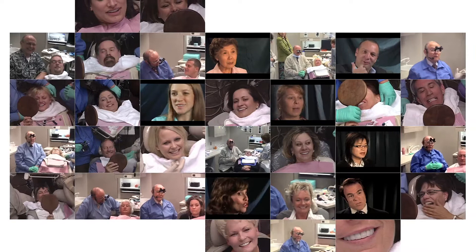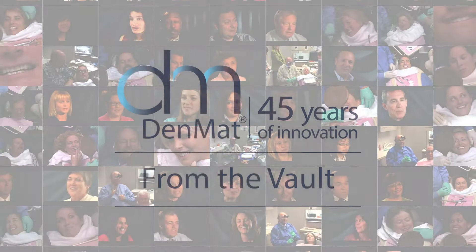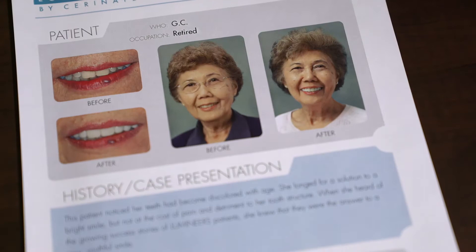And now we're not treating teeth anymore. We're treating smiles. Isn't that beautiful? Let's look at the transformation from where we started and where we are. Our patient today is an example of that.